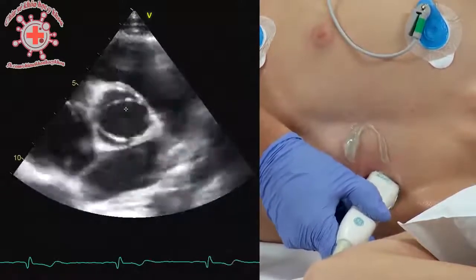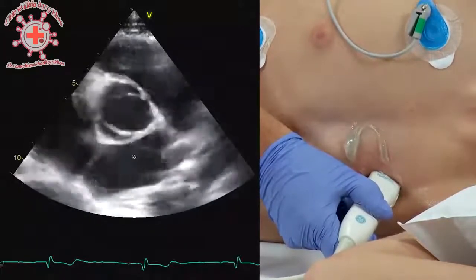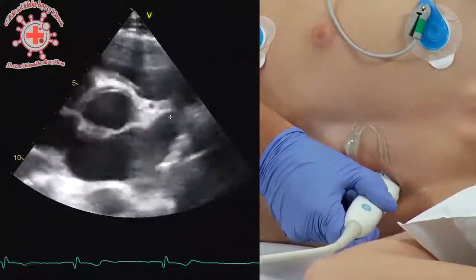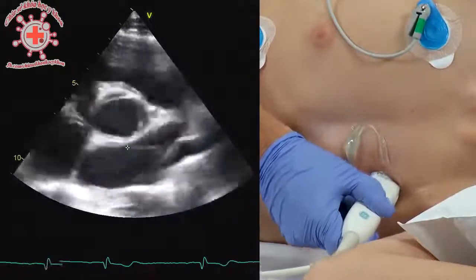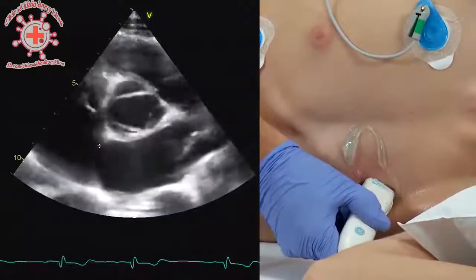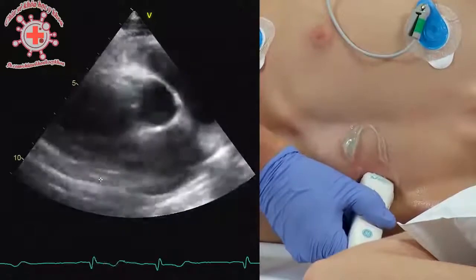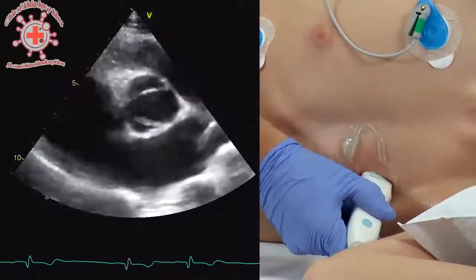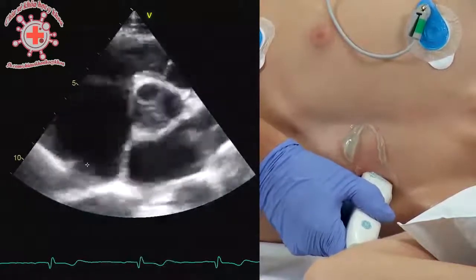But now, showing you the other structures you see. This is the left atrium. If you tilt the transducer a little bit more caudal, you can see the left atrial appendage here. And if you move the transducer back, it's very nice to identify the intra-atrial septum. If you turn to the right atrium and move the transducer a little bit more, focusing on the right atrium, you can also see the IVC as it enters the right atrium.